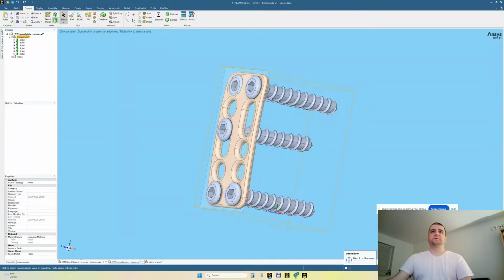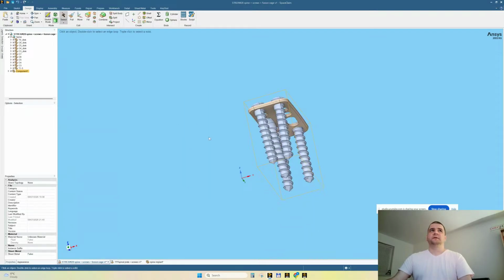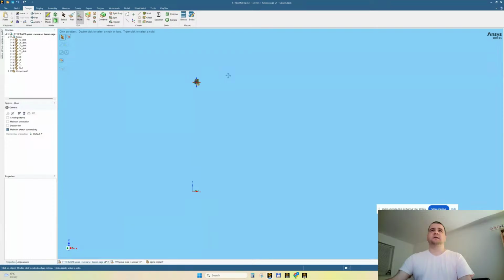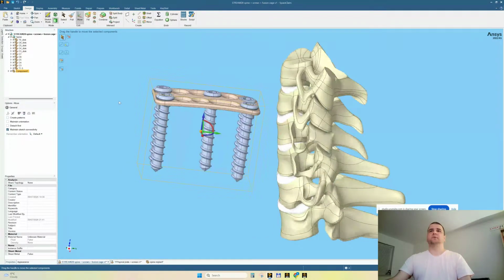And here we are going where we have the spine, and Control V or paste. I could have pressed paste here. So they are kind of thrown away in the macrocosmos. So at this moment, we're going to move one subassembly towards the other. All right. Zoom extents. Perfect. So it's kind of what we need and what we want.